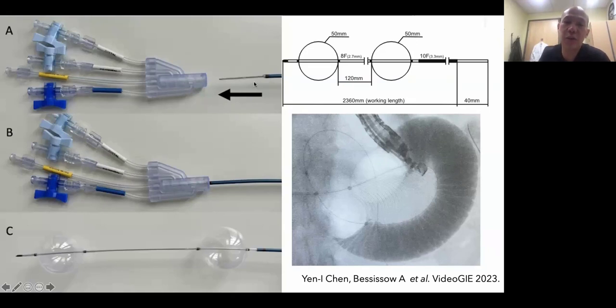to let the catheter be bare on the backside, so that when we insert this catheter to a location, we can remove the endoscope and keep the catheter at its location. We then push this hub onto the catheter. With multiple independent lumens, we can infuse the distal balloon, the proximal balloon, the guide wire, and the infusion lumen.